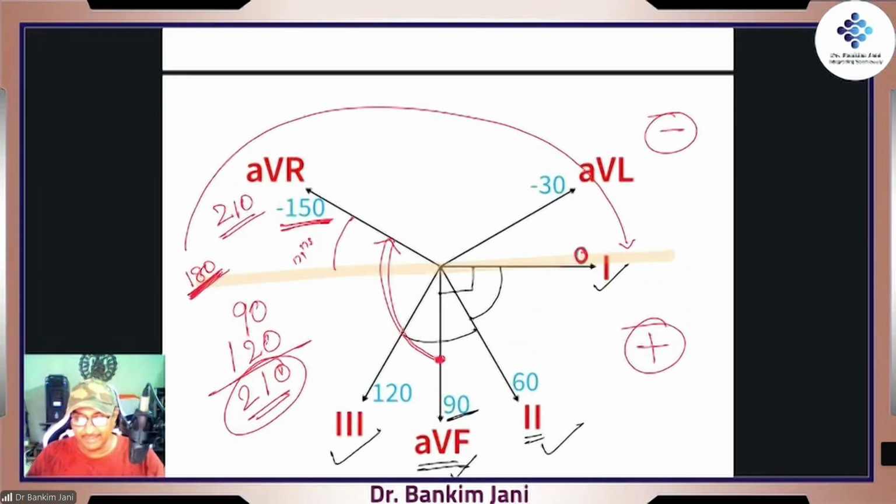But these angles at that point, we won't be able to go back to these angles. It has to come in a fraction of a second. That we are talking about AVL. Yes, we are watching the heart from an above angle, -30. So if the heart has shifted to that angle, yes, that would be the strongest signal, right? Because we'll keep on doing the reverse engineering.